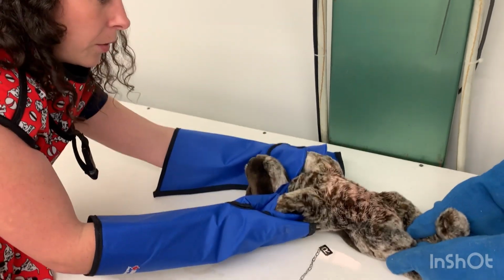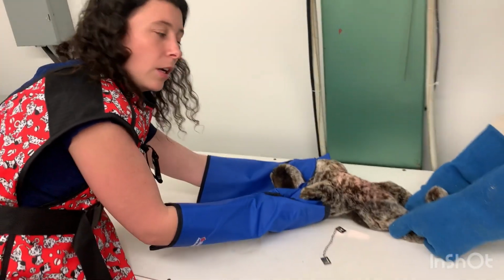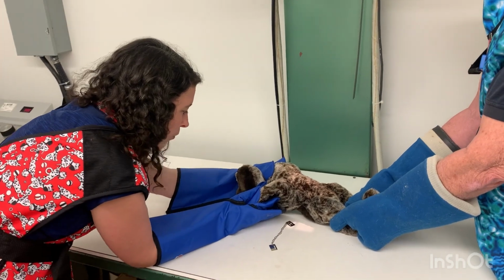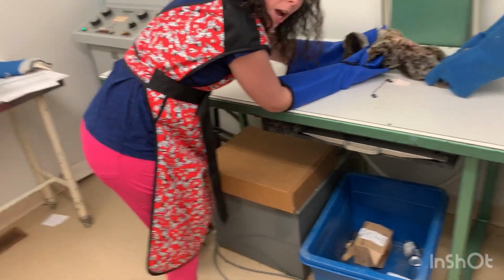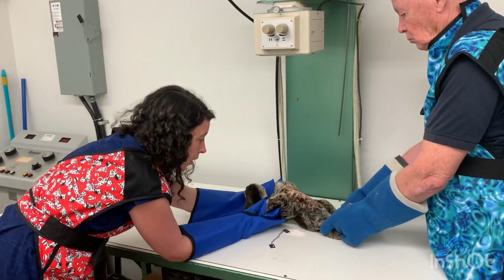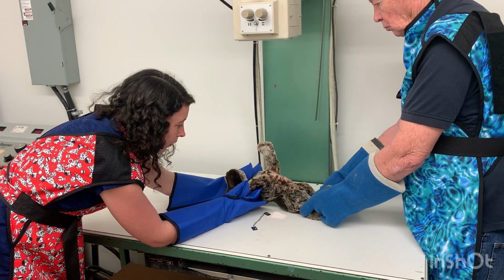So we're in a good position here. I'm not changing our settings at all. I'd be pressing down on our foot pedal again, waiting a few seconds, and then fully pressing down to take the image. And then we would be all set there.